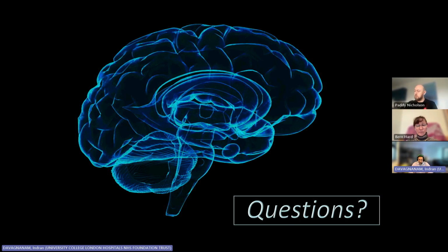So, for example, we do what's been promoted as resisted inspiration, which is essentially akin to trying to breathe through a very, very small straw. So taking a deep breath in. What that has been purported to do is to increase the return of venous blood through the superior vena cava, this large conduit back into the heart, and therefore, if there is a point of escape of CSF into the venous system, promote that egress of contrast into the venous system.